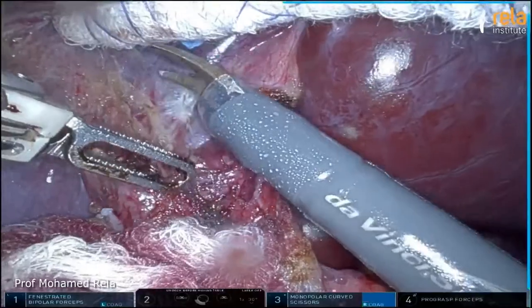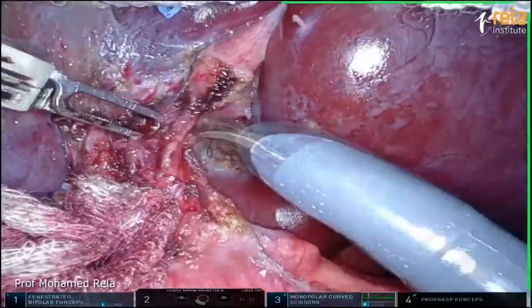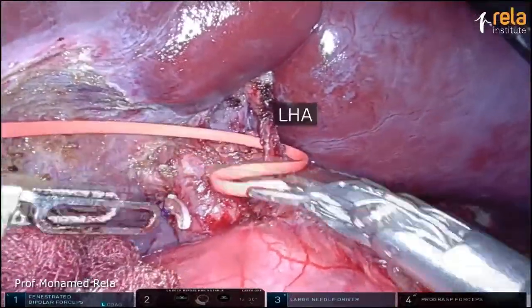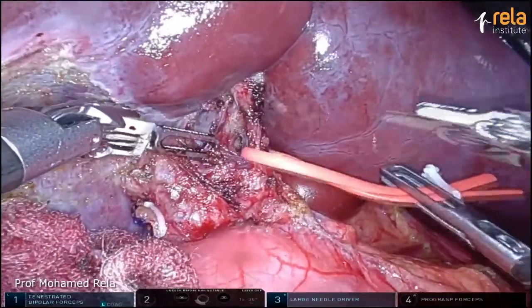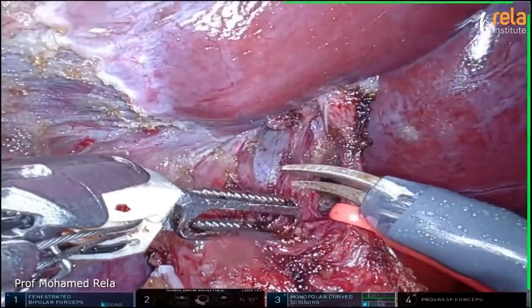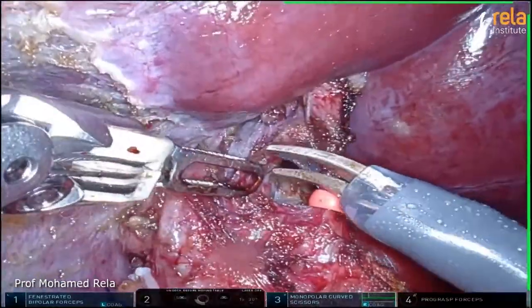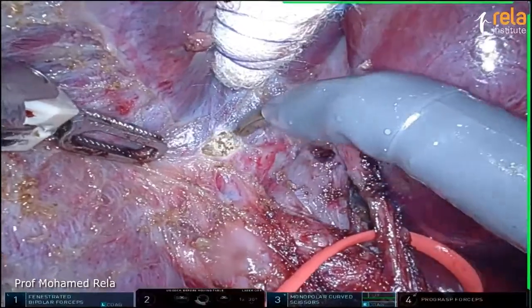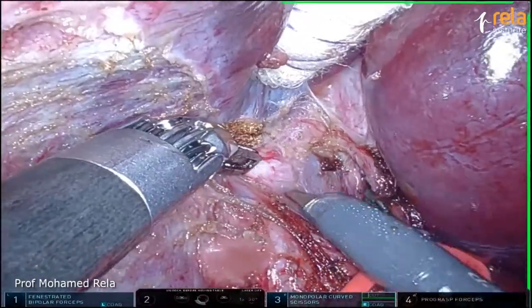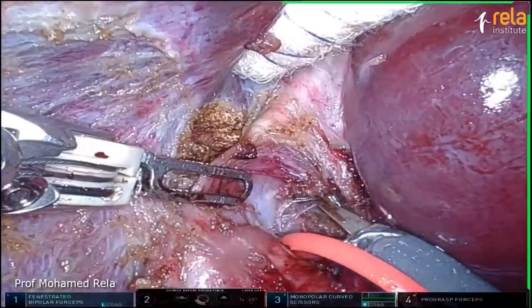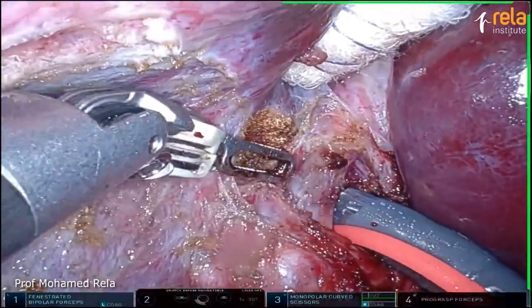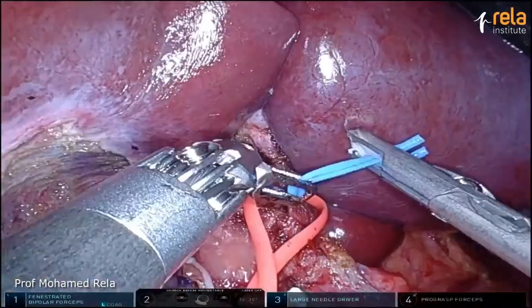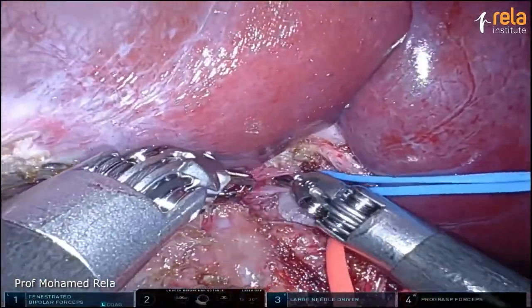You might find that there are some caudate vessels on the left-hand side. Clearing some lymphatics around the left hepatic artery — there is a sling around the artery. Lymphatic tissue around the portal vein is being divided and skeletonized. That's the left duct that you can see. Just clearing the tissue so you can go around the left duct later on. We won't dissect the left duct any longer. This is the left portal vein, and now a sling around the left portal vein.